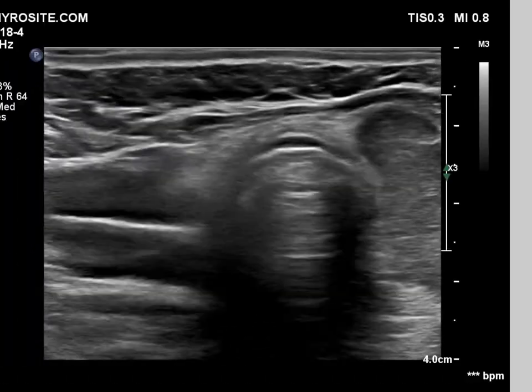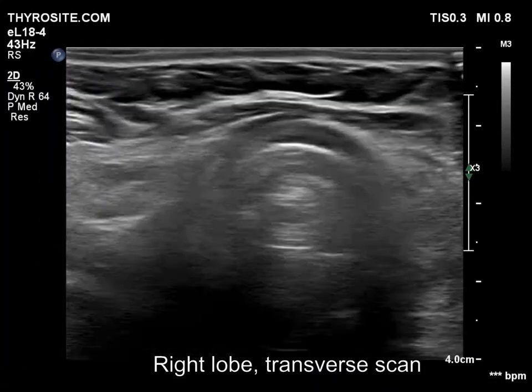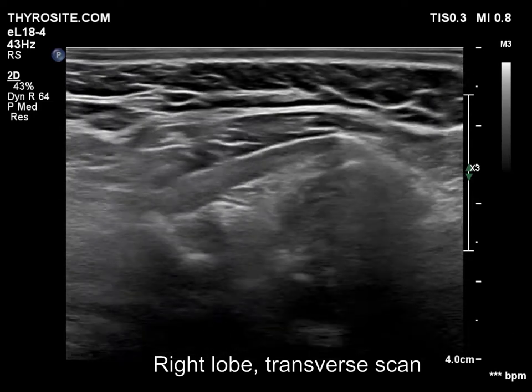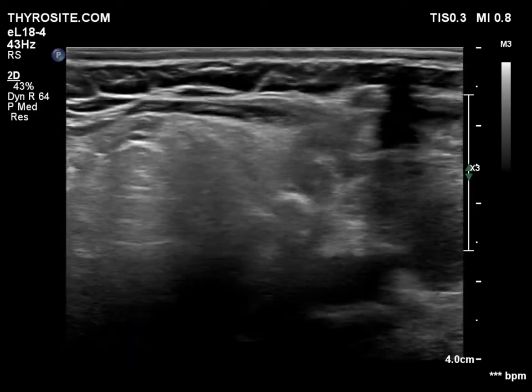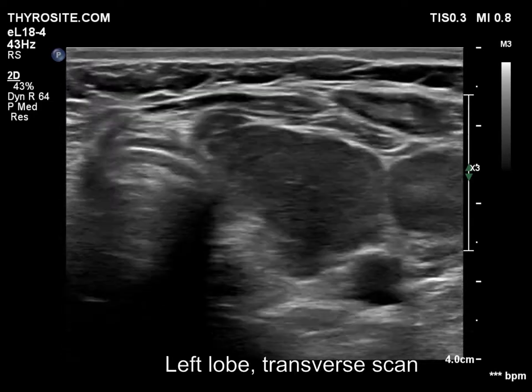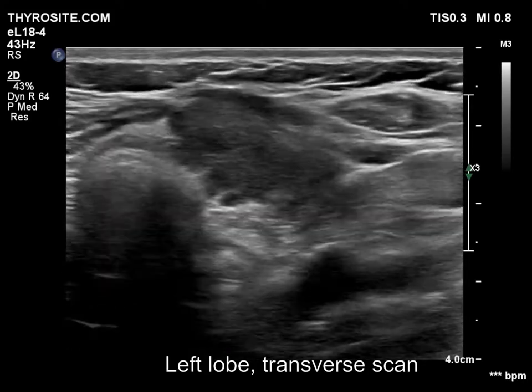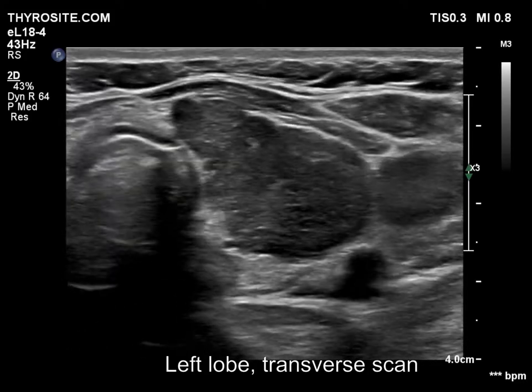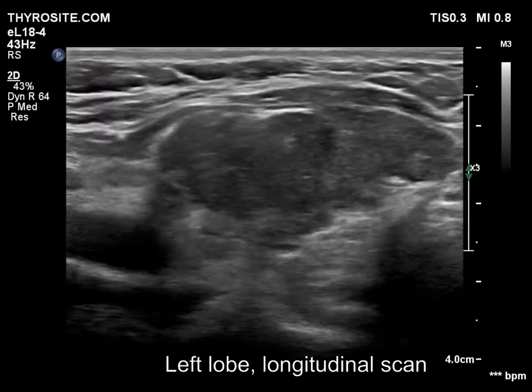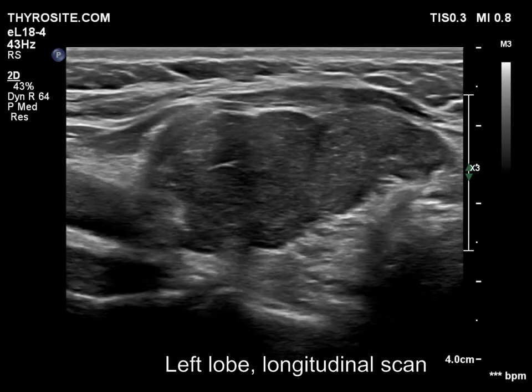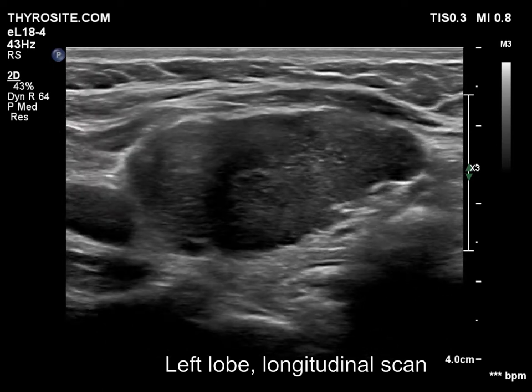There is no parenchyma according to the right lobe. The left lobe is composed of a central hypoechogenic area surrounded with a relatively thin, echonormal rim. The latter corresponds either to thyroid tissue with a different vascular supply or to connective tissue.